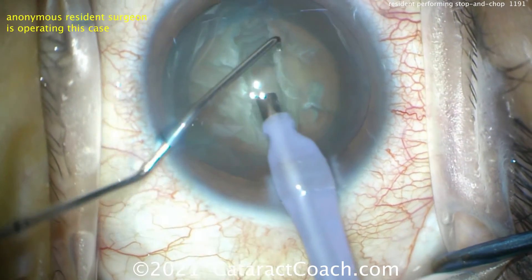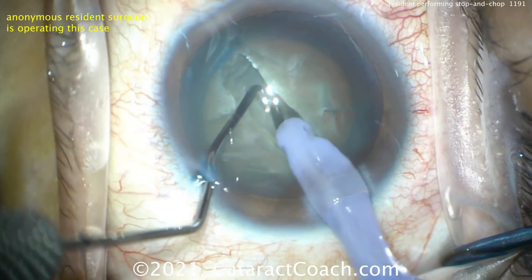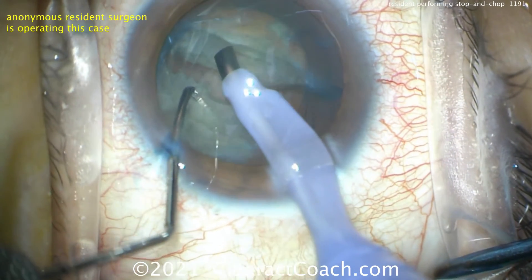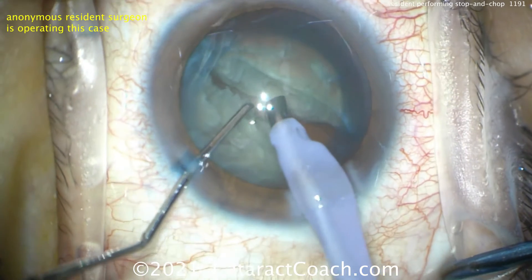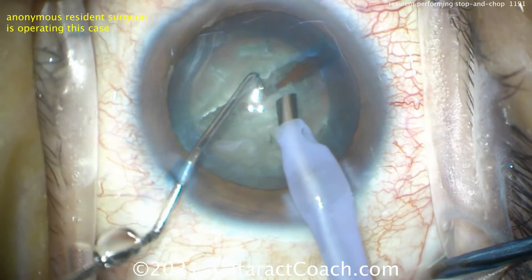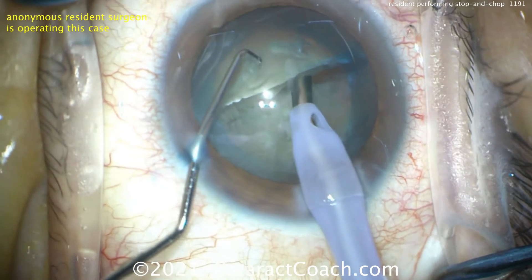There's a little bit more red reflex in the center way down deep. Now both instruments are placed deep within the groove and pushed apart — look at that nice separation. This is probably a modest, maybe 3-plus nuclear sclerosis. Really making sure the halves fully separate. Then rotating to set up for success.